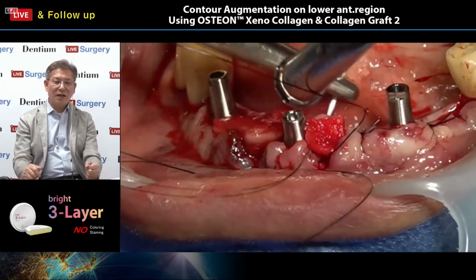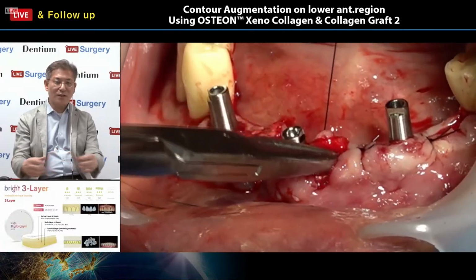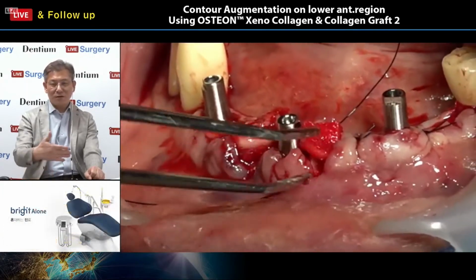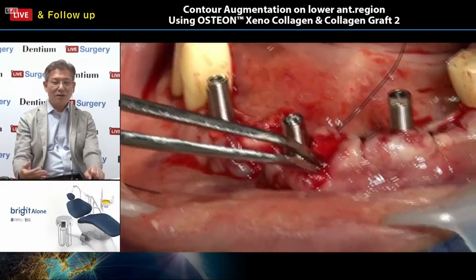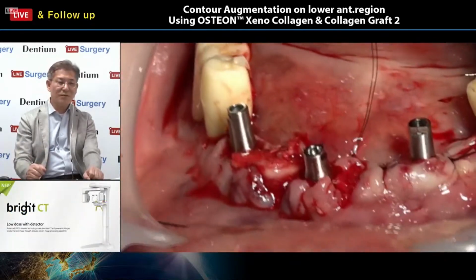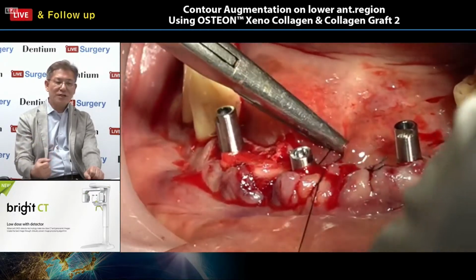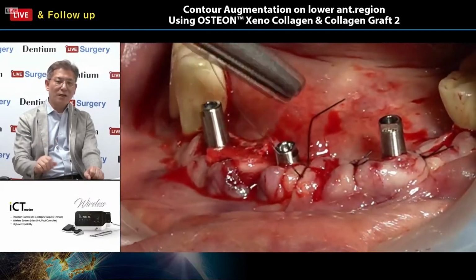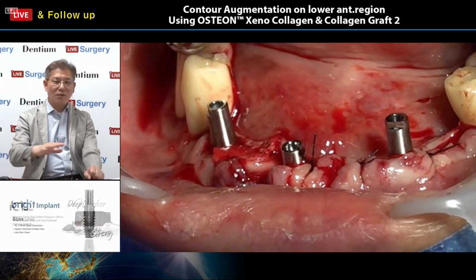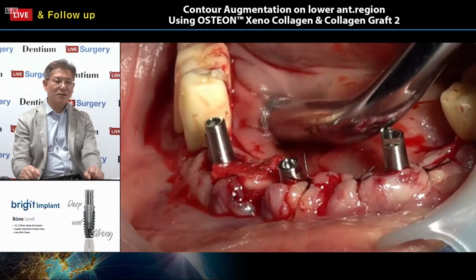After that, when you have implant surgery, we can see very nice, well-organized new bone formation in the socket, right? The same applies even in periodontally compromised cases, loss of the labial wall, or loss of the proximal wall. Extraction, removing all granulation tissue, packing with collagen bone like osteogenocollagen, and covering with this collagen graft.